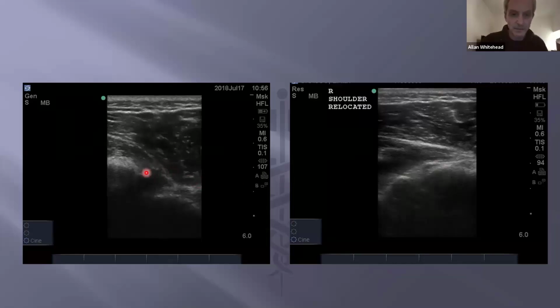And again, in the space back here, there's a bit of blood and clot. The good thing about it, when I talk about the intra-articular injection later, is you're always going to have a nice, almost couple of centimeter diameter distance to aim for your injection.